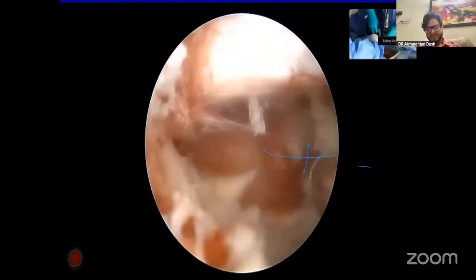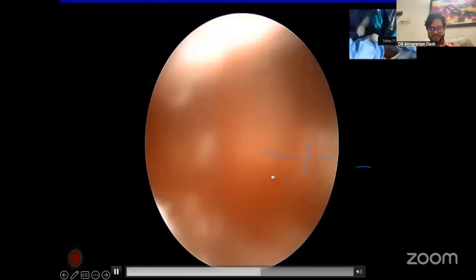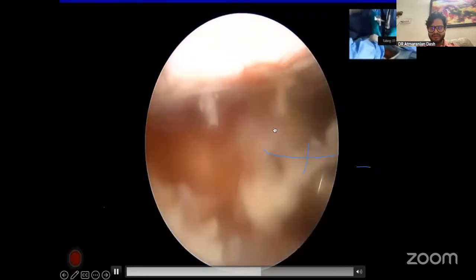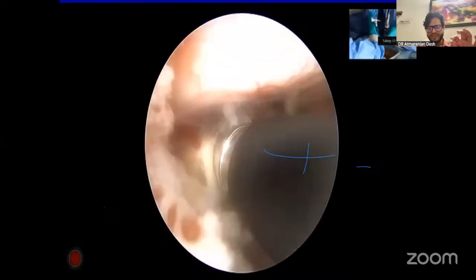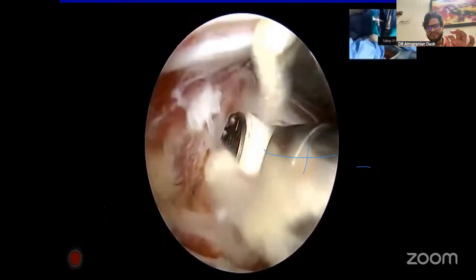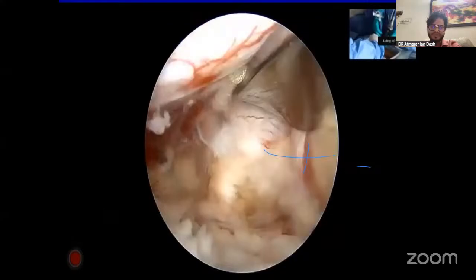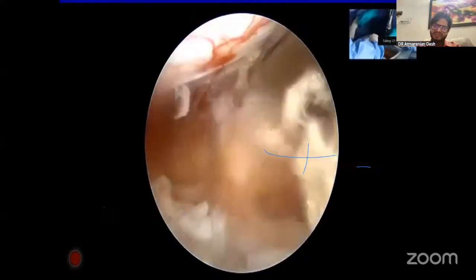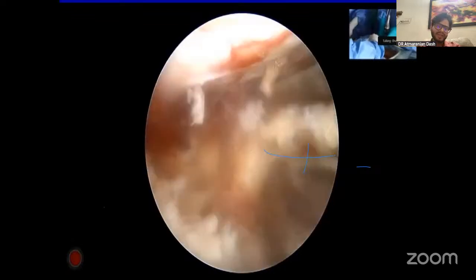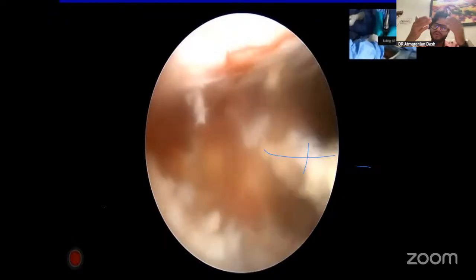So here, structural appreciation of unilateral biportal endoscopy is very, very good. You can appreciate the PLL, the crisscross fibers, everything of the disc. So you can differentiate. Sometimes you may have a large disc bulge. Sometimes the thecal sac is so much blanched that you think it's an annulus, not thecal sac. But here you can see structures very closely, because your eye goes inside the body.